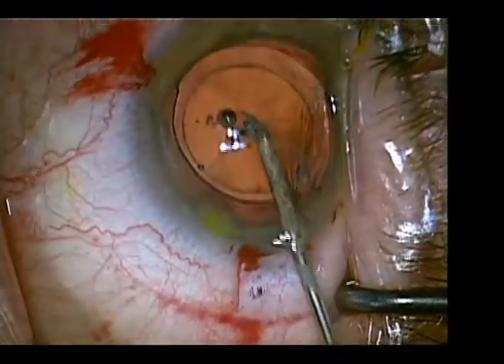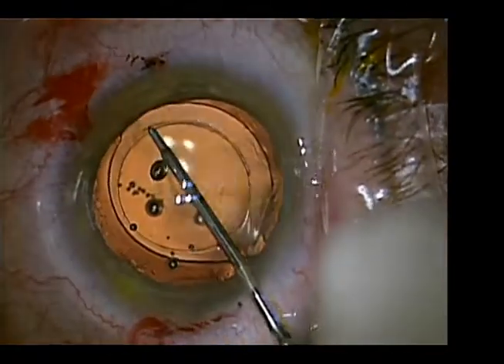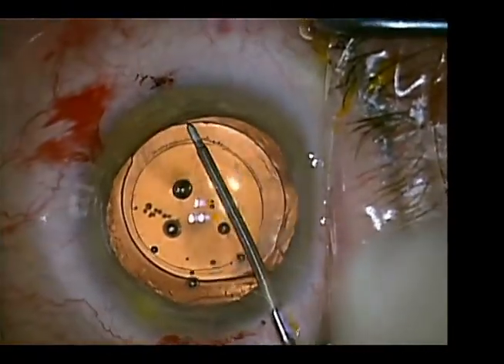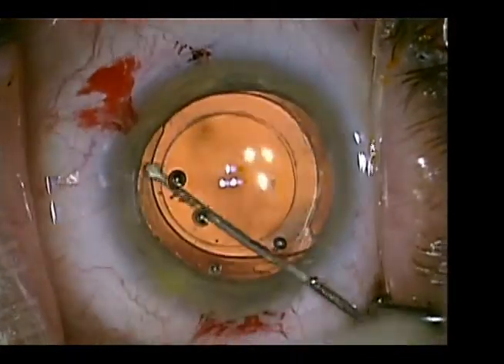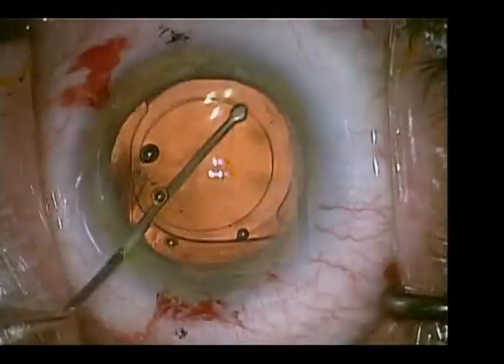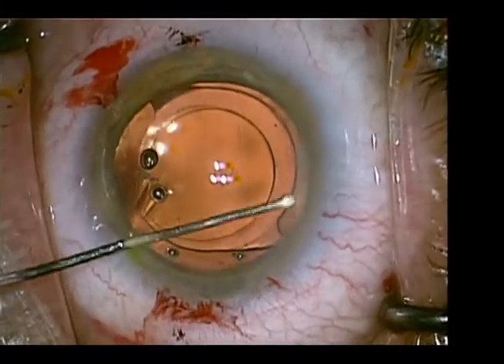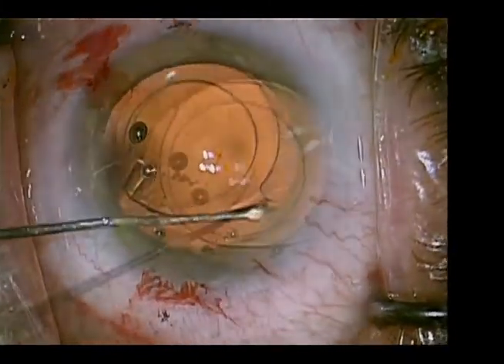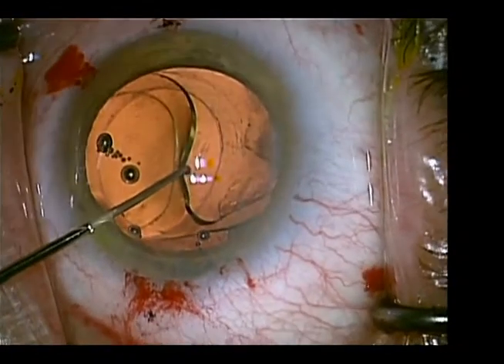to free the laser cut anterior capsule edge. A Donnenfeld spatula is used to separate the anterior capsule from the underlying anterior surface of the IOL, and then with blunt and visco dissection, the capsule is separated from the anterior surface of the lens for 360 degrees.